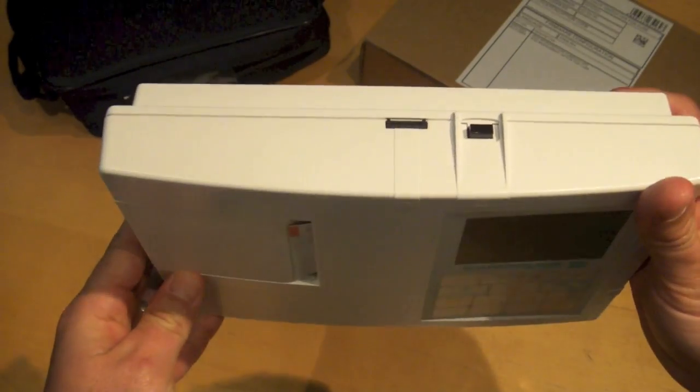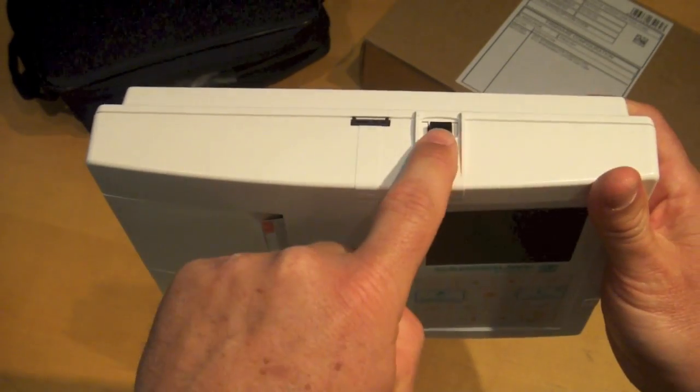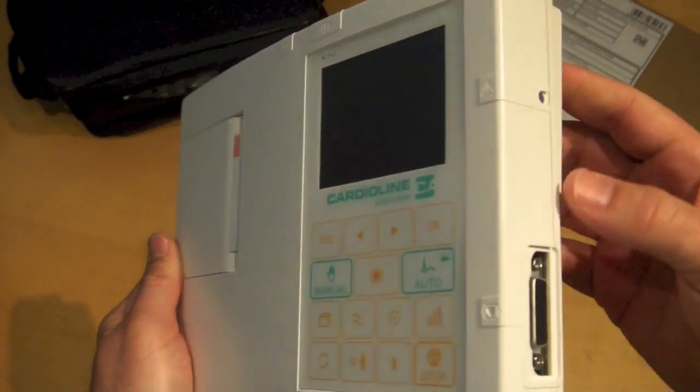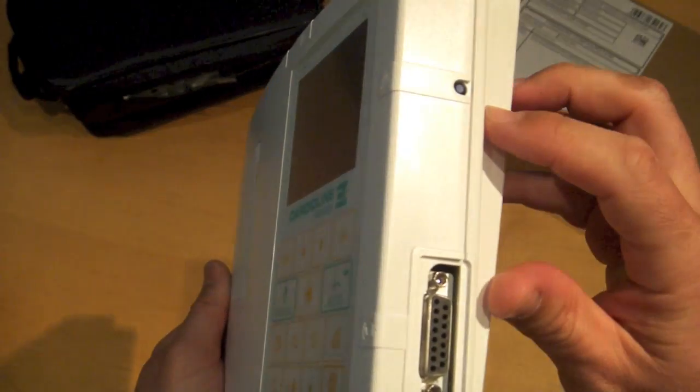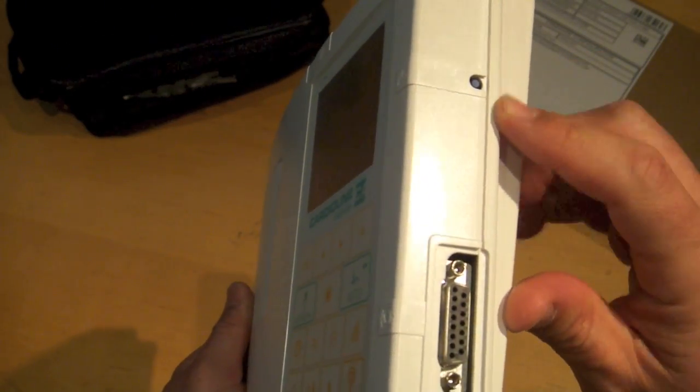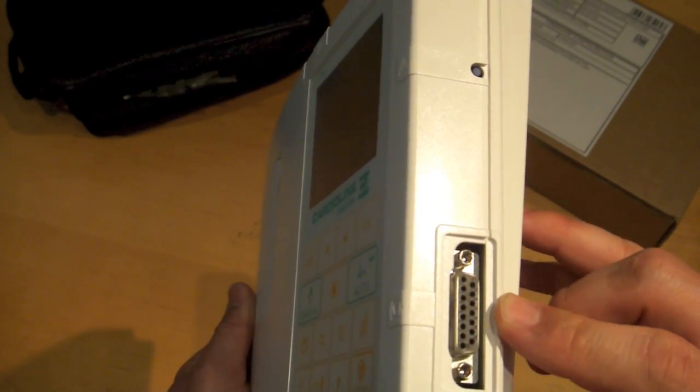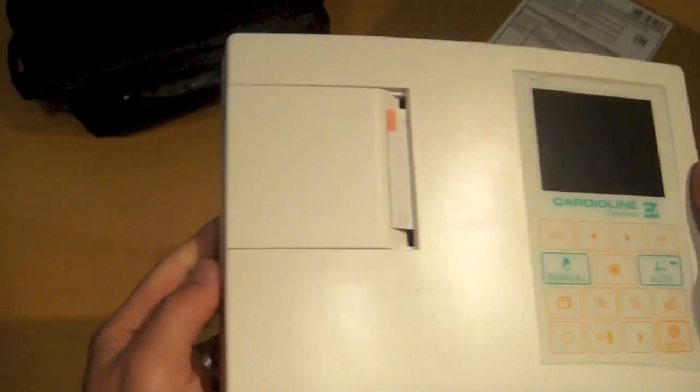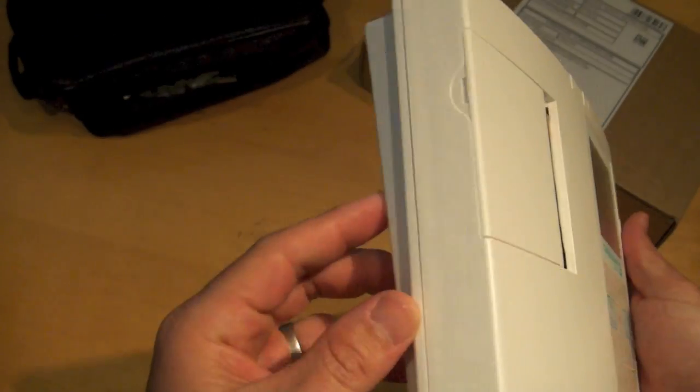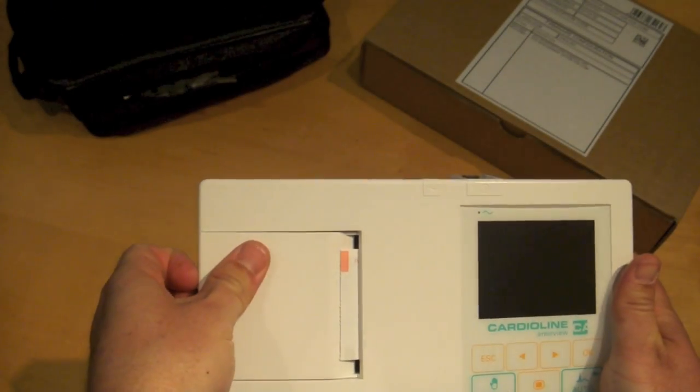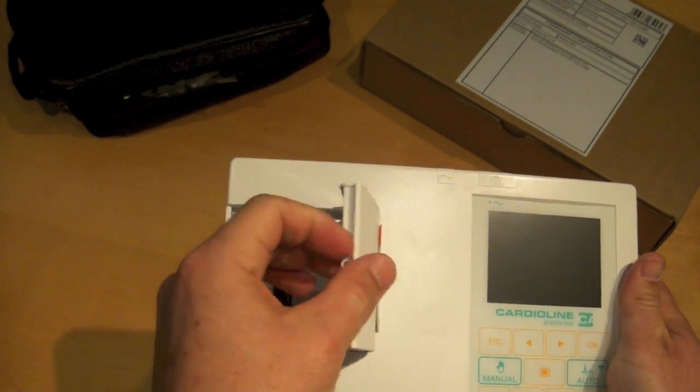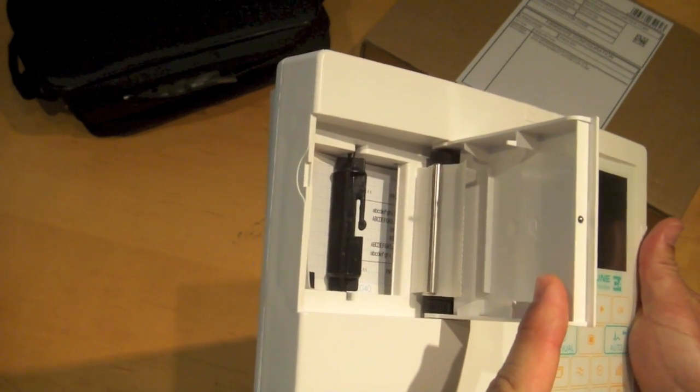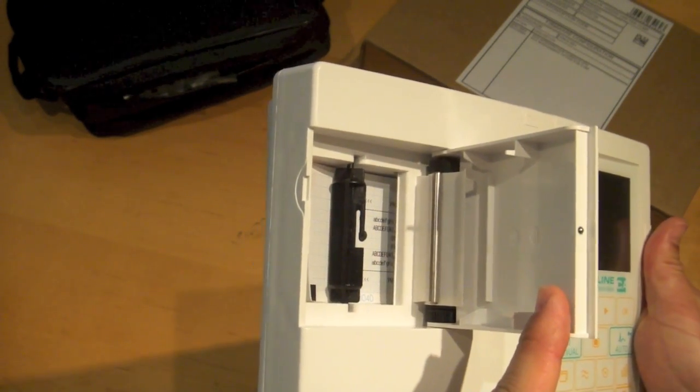On the top of the machine we have the power button. The right of the machine is a reset button, a patient cable connection. And to the left of the machine is the thermal printer door, which we can open here and show you inside the machine.